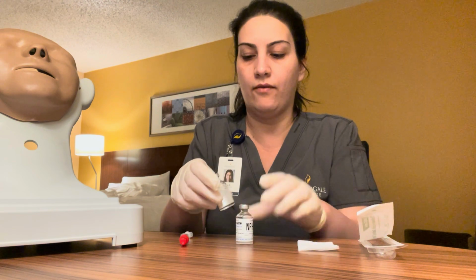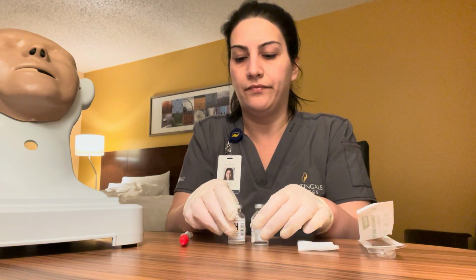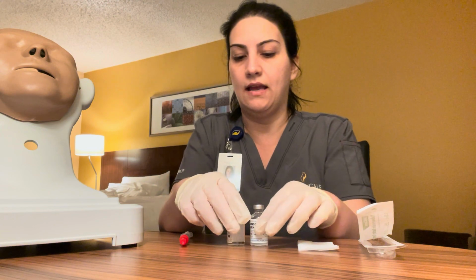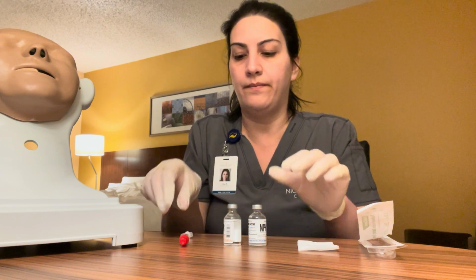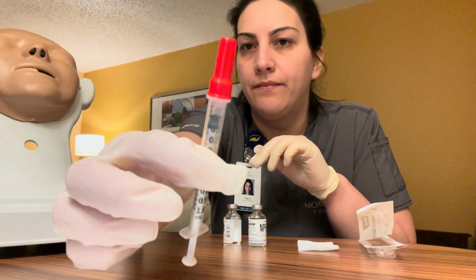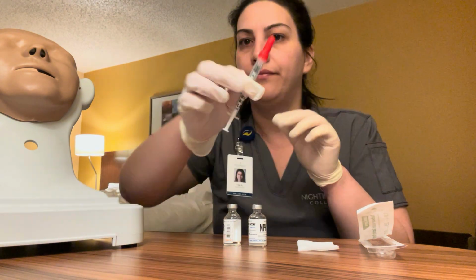Awesome. So now we're going to get started. We're going to start with the intermediate. 8 units of air. Nurse and I verify against the MAR, 8 units of air.